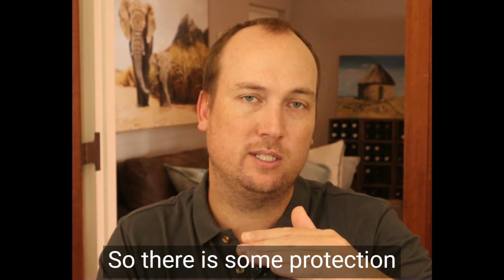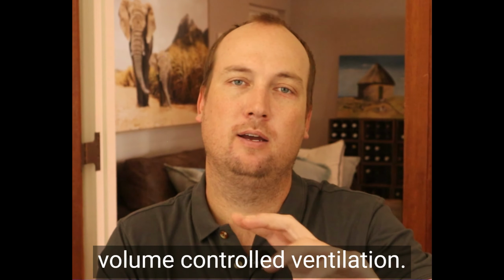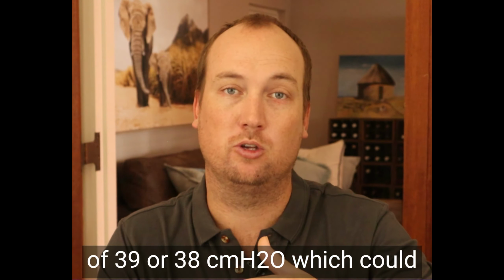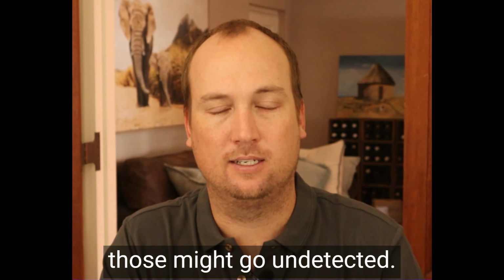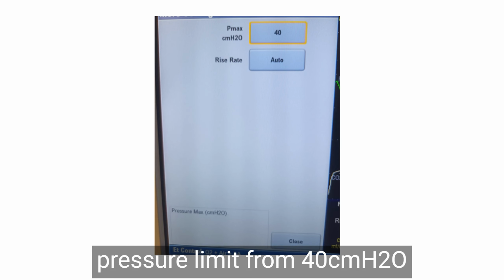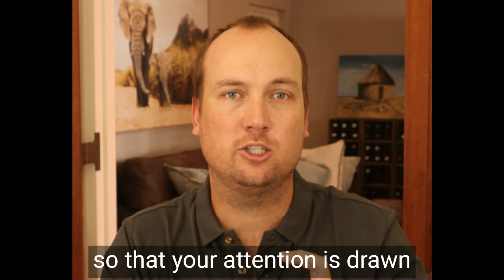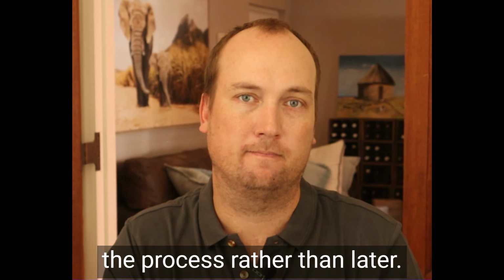So there is some protection against barotrauma in volume-controlled ventilation, but one can still have pressures of 39 or 38 centimeters of water, which could be doing harm to the lungs, and those might go undetected. One can make this mode a little bit safer by decreasing your pressure limit from 40 centimeters of water down to 35 or 30 centimeters of water, so that your attention is drawn to the high pressure earlier in the process rather than later.